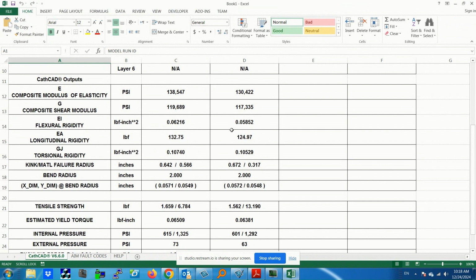So you'll see basically we've got the new design being a little more flexible. On the order of 5% more flexible. Here, that's about 8, so less than 10% change in pushability. Torque is basically the same. And again, here's where common sense comes into play. Why is that the factor? Most of your torque is coming from the braid layer. And that matrix material that's filling the braid did not change. Basically, it's still PEBAX 72D. So we would expect our torque to basically not change at all. And that's what we're seeing here.